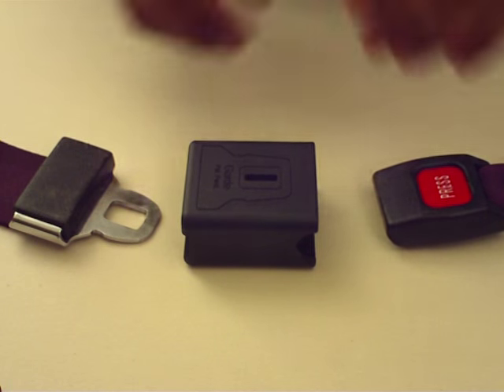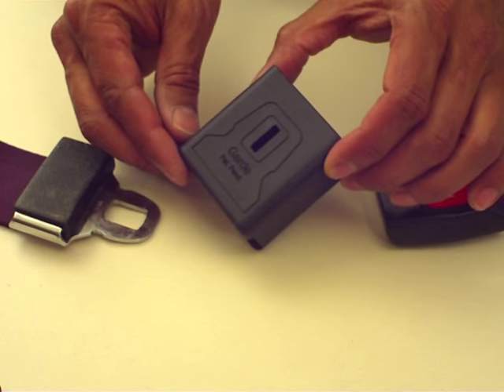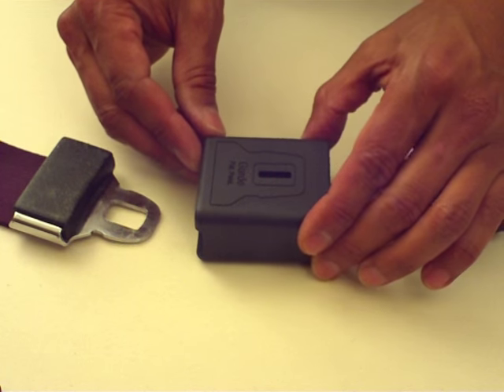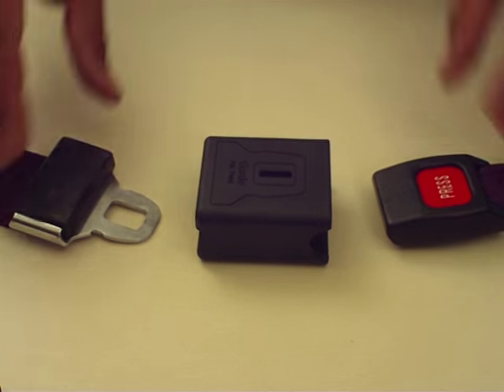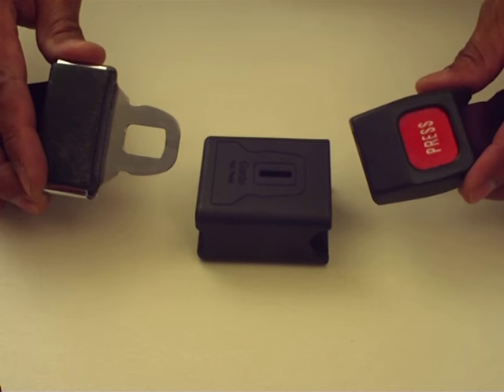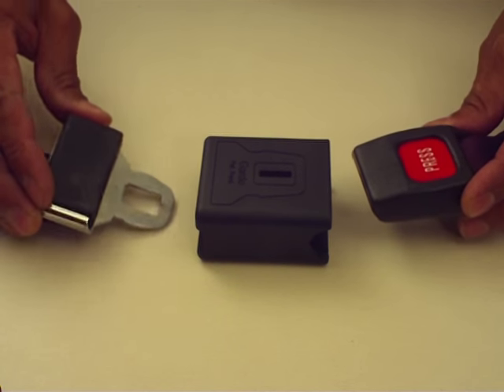The Guard A System's Buckle Guard is a security cover that surrounds the push-button buckles that are used in medical and paramedical safety straps. The buckle guard fits the majority of the safety straps in use today.